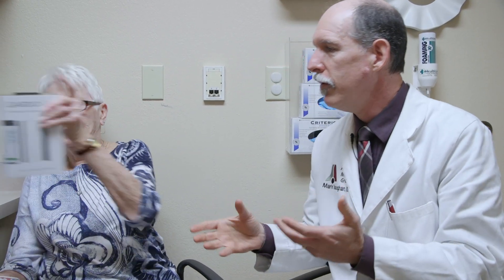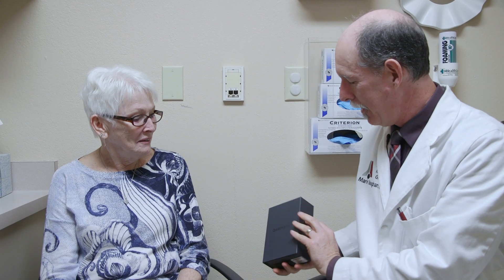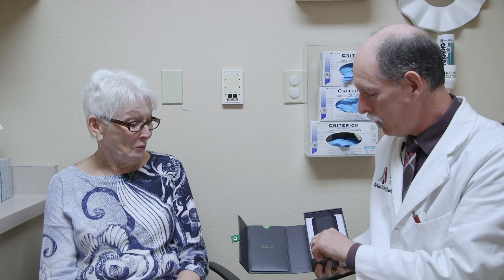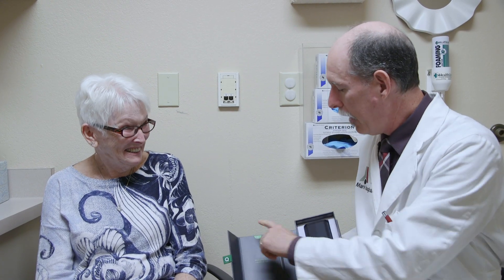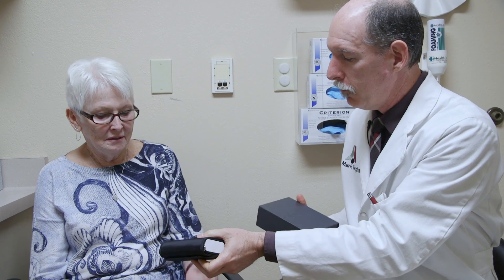We will take it out of the box. It is rather compact once you get it out of the packaging. I also write down the serial number — I think it's good practice to always write down the serial number of the device we provide to patients. You can stop the service at any time, but we ask that you return the product. It has instructions here for how to reset the Bluetooth connection if you need to. That's how small the unit is.